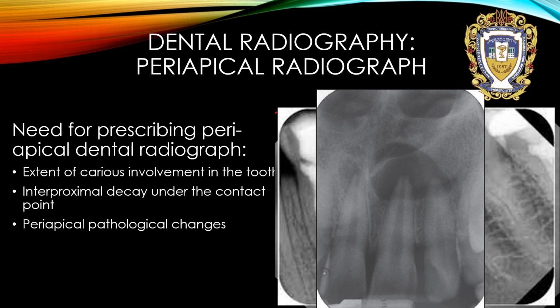But this tooth was not previously treated endodontically. Maybe it is a complication of deep caries treatment, and as a result pulpitis developed, and at the next stage, periodontitis and cyst.